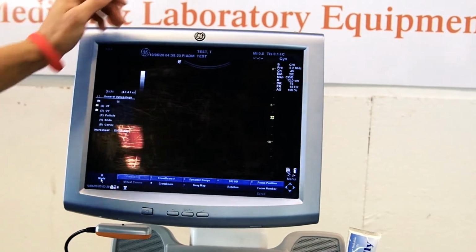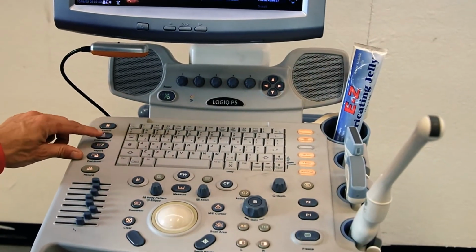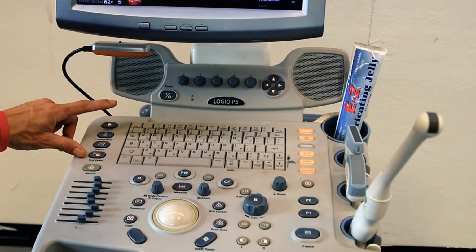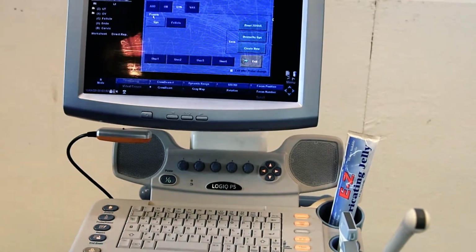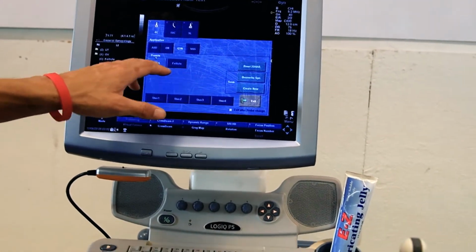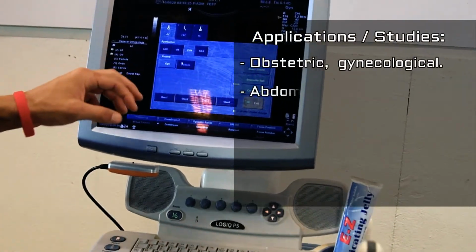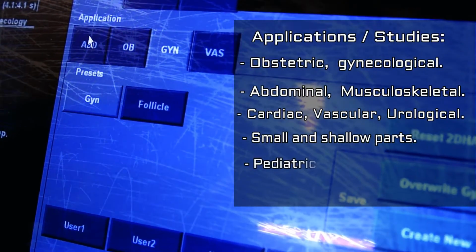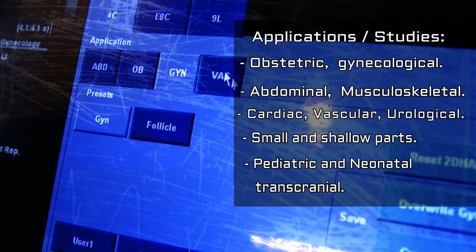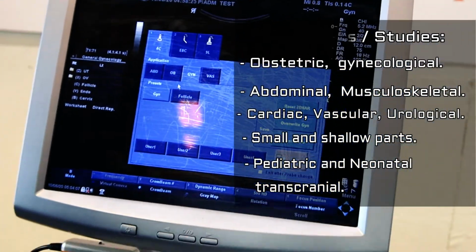Now we'll have all the patient information that we put in here, and then you can start your procedures. To choose which transducer you want to use, you can come down here to where it says probe preset, and you can click on the probe preset. Here you can change to whatever procedure you're trying to do, whether it's gynecological, follicle, vascular, OBGYN, abdominal, all the different selections here for the actual procedure. Now we're going to go ahead and use the convex transducer first.